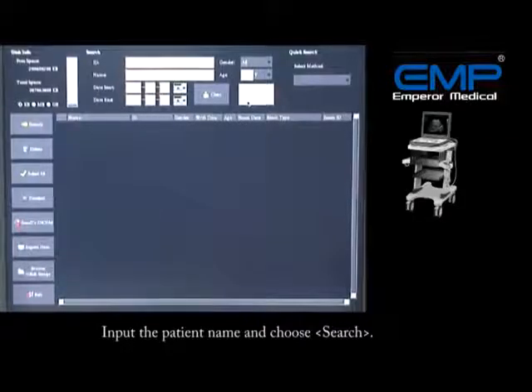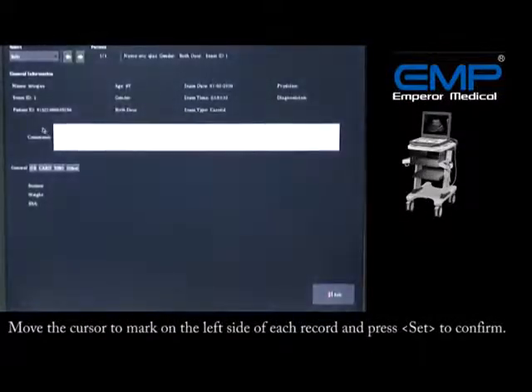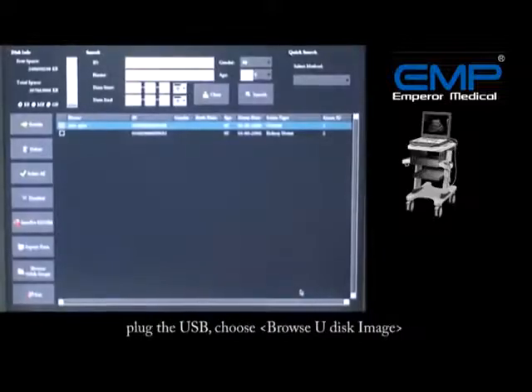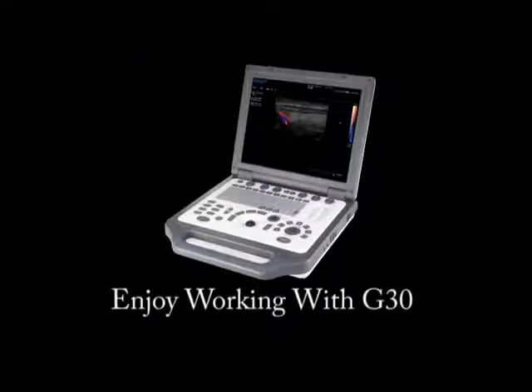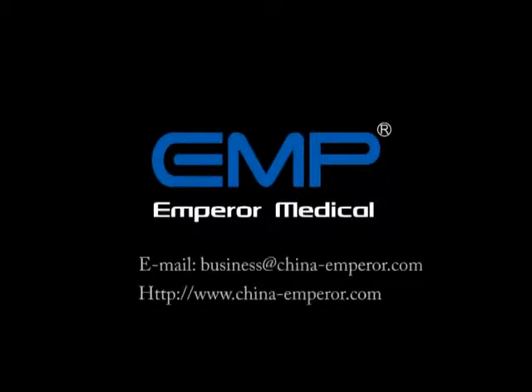Input the patient name and choose Search. Move the cursor to mark on the left side of each record and press Set to confirm. You can also view images from a USB drive on the screen — plug in the USB and choose the USB disk image.